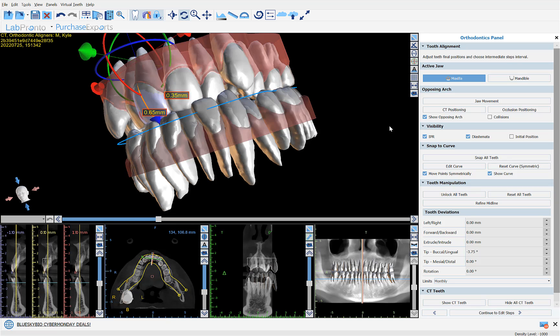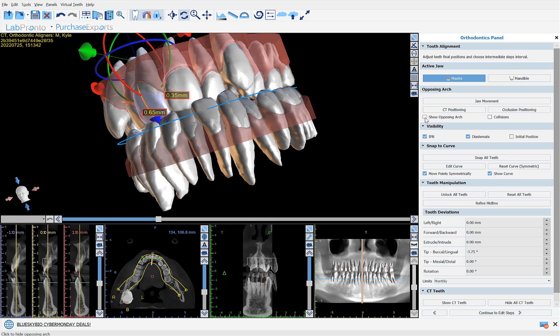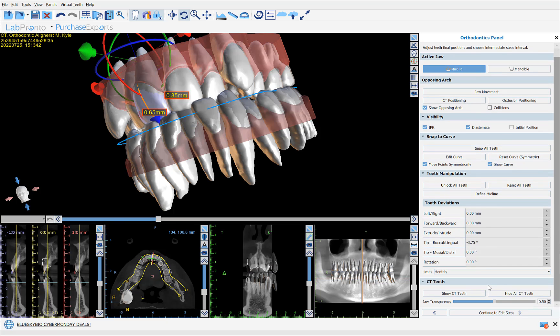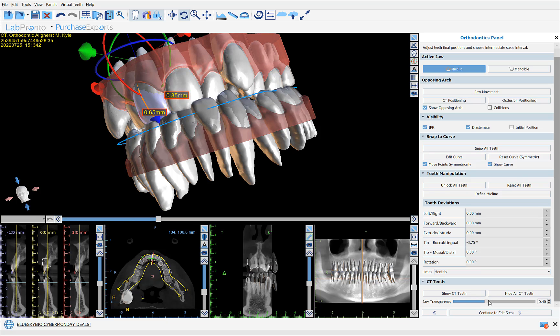If we want to hide one arch, we could simply uncheck the show opposing arch button to see just an individual arch, and we could also use the slider to control the transparency of the STL model.